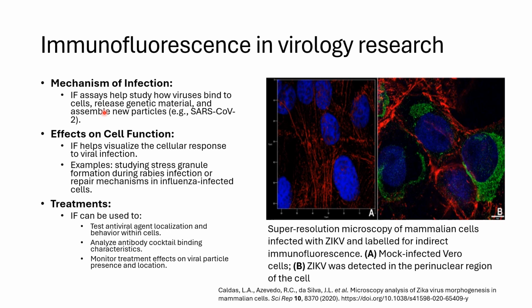It helps monitor the treatment effects. Immunofluorescence can be used to test antiviral agents, to localize them, and to study their behavior within cells. It helps to analyze if the antibody cocktail shows any binding to the viruses. It helps monitor treatment effects on viral particle presence and localization.